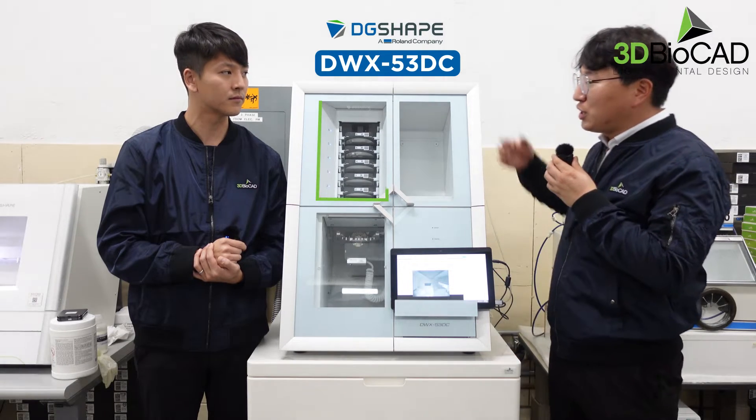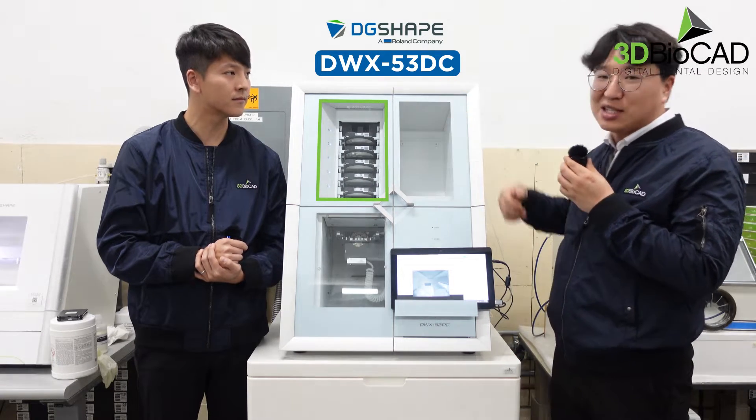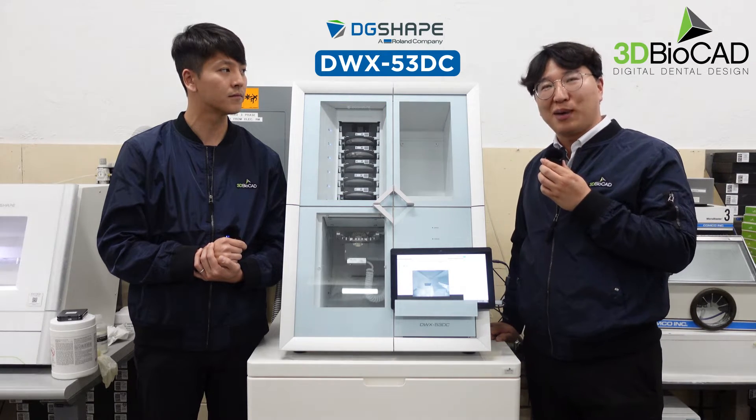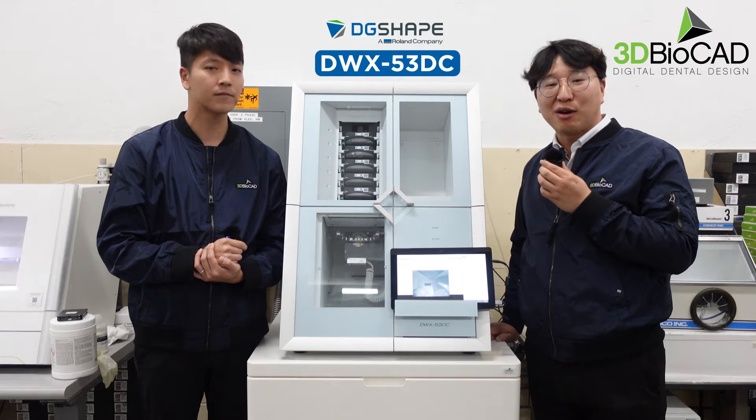Our new disc changer machine here — we have a 6-disc changer, very stable, very nice work. We've been using it for about three weeks now and we are very happy and very satisfied with it.